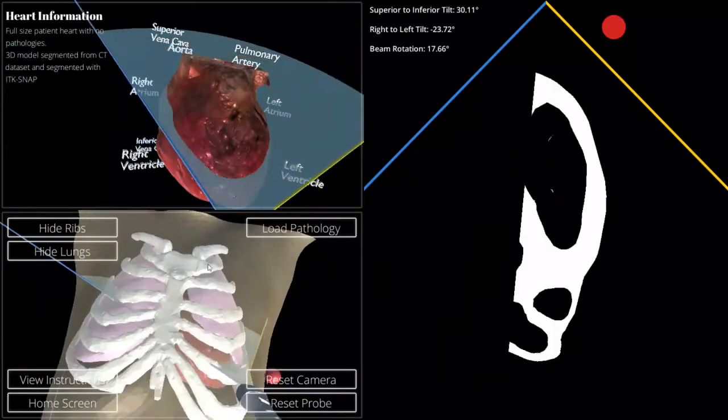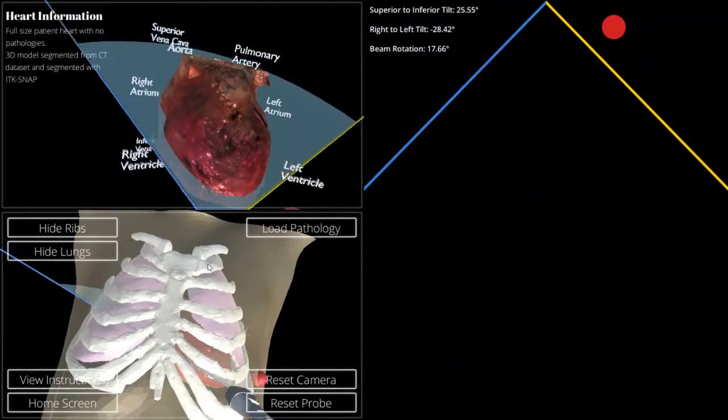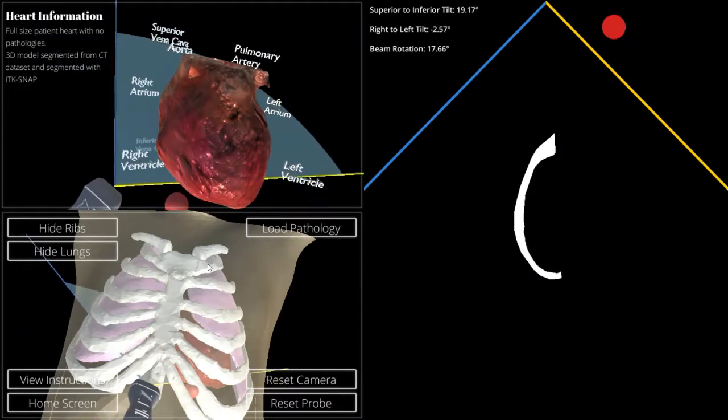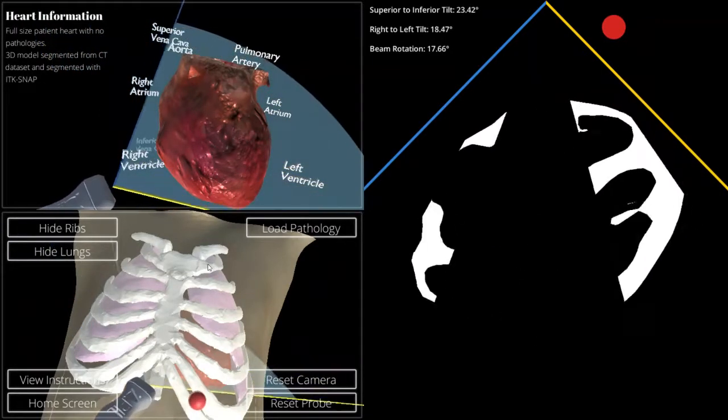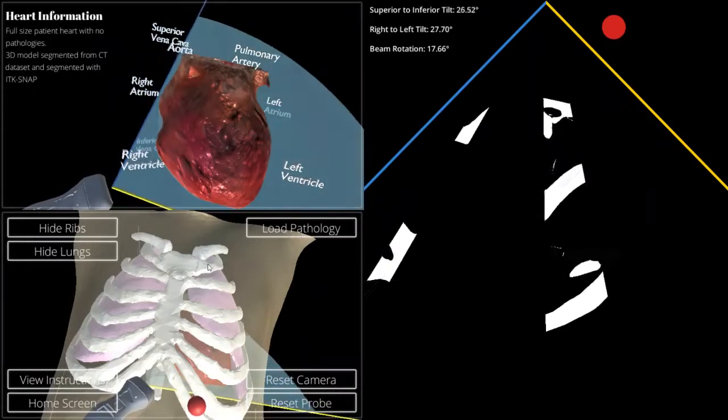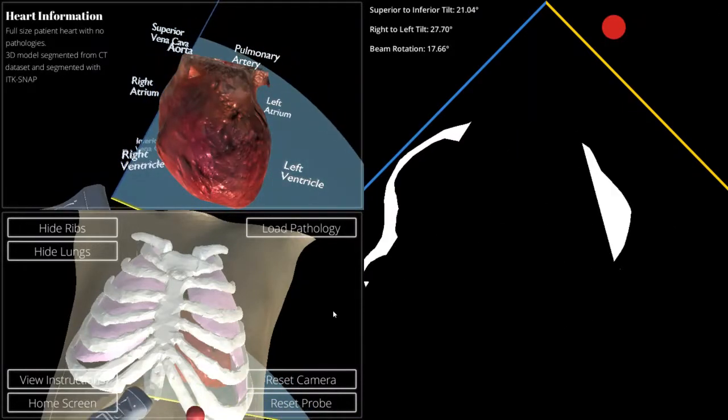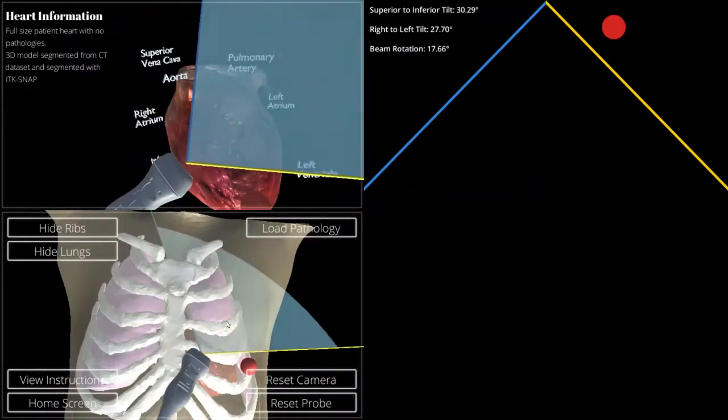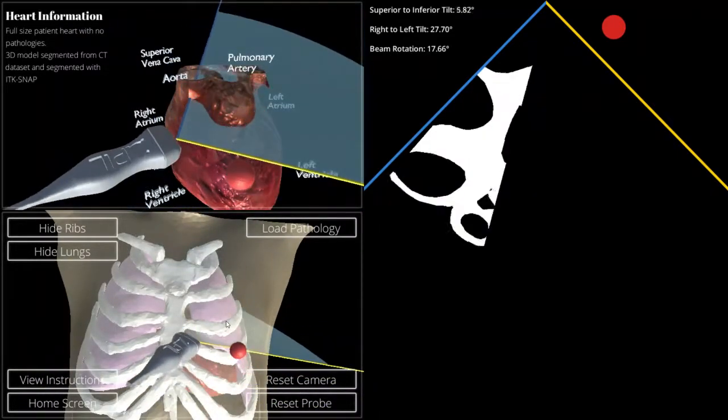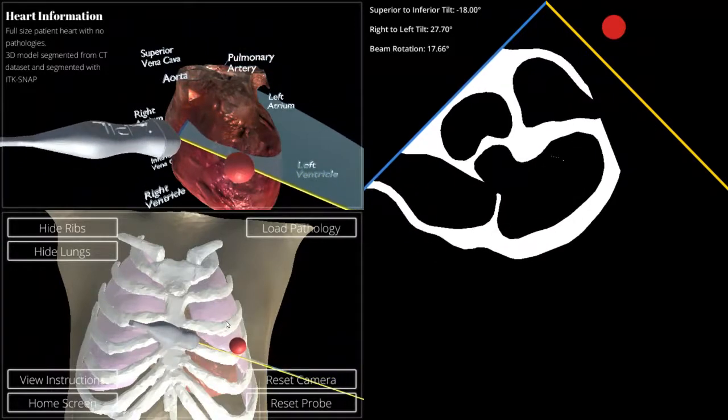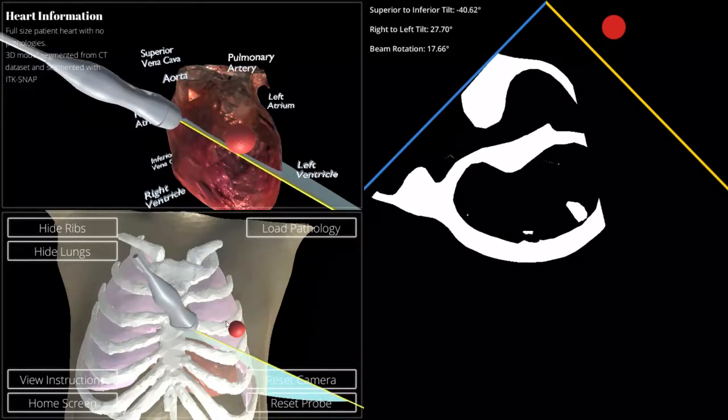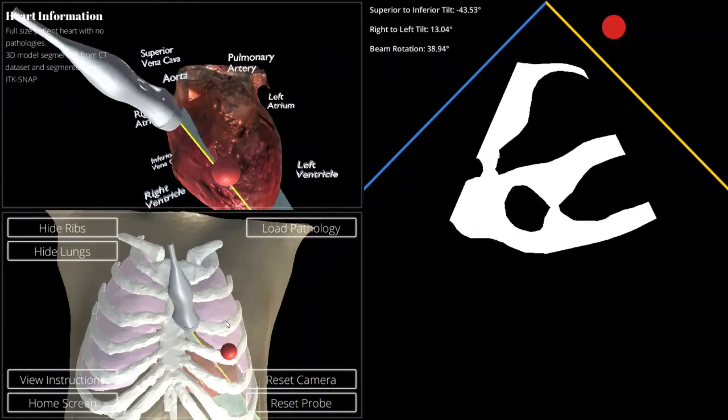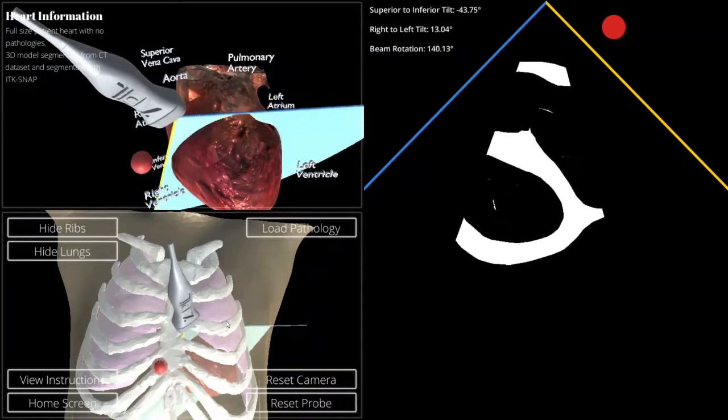We can then go through and repeat this exercise for all the different ribs, and even subcostal will work. This entire thing is driven by the keyboard. Subcostal is a little bit trickier because of the notch of the ribs, but it is possible. And if we were trying to get the long axis view, that is also certainly possible by going through these two ribs, positioning it correctly, and rotating the beam itself.